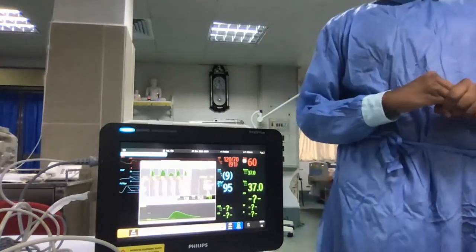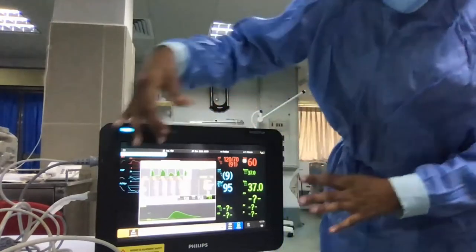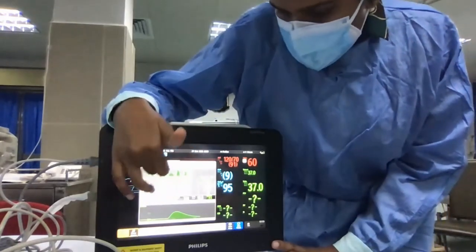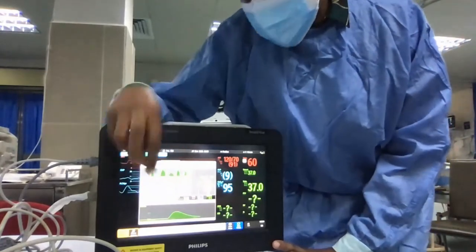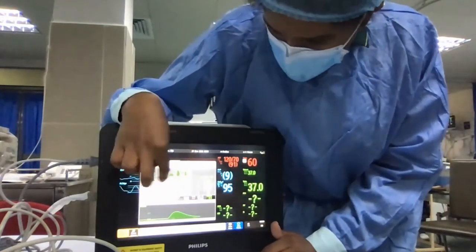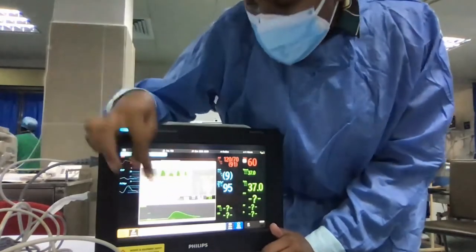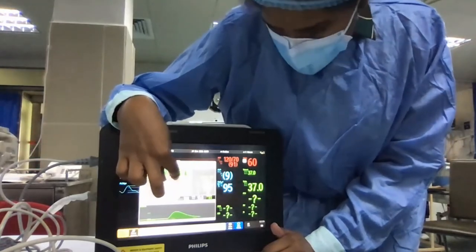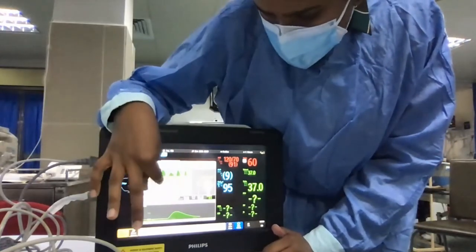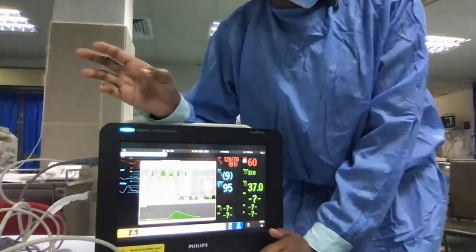So the readings that we get are accurate, because the kind of temperature drop is different. So we have got around 5 measurements. Using these 5 measurements, to calculate the average, select the closest measurements. Like see here, 11.4, then 5.66 is too low. Then again 11.4, 8.5 we can rule out. Then 11.3. So I will just choose the first, third, and fifth measurements for my CCO calibration, continuous cardiac output calibration.